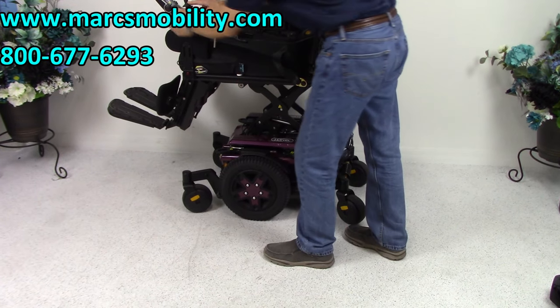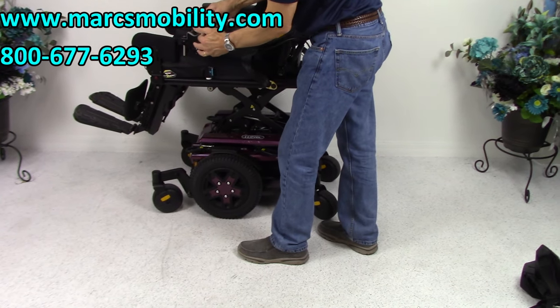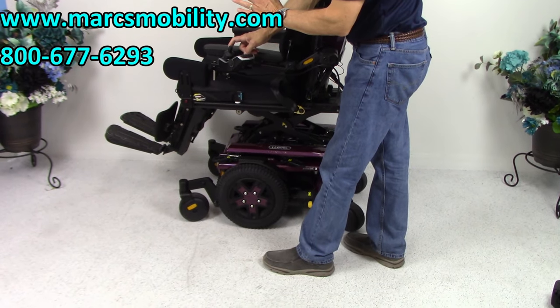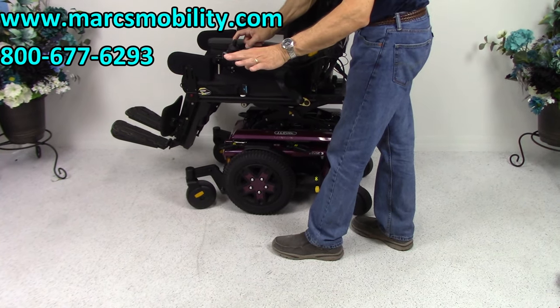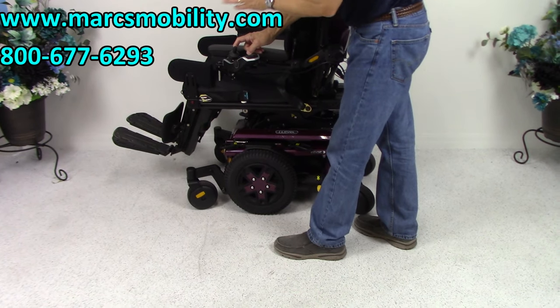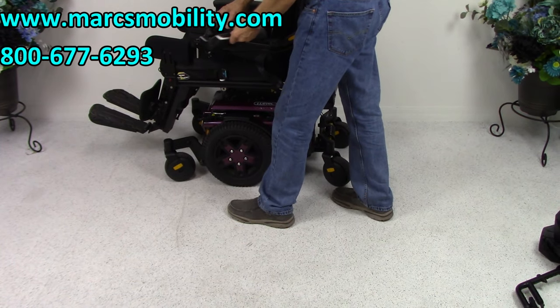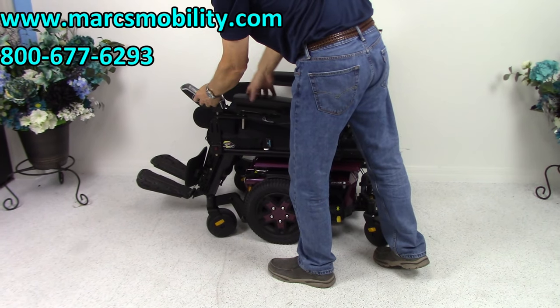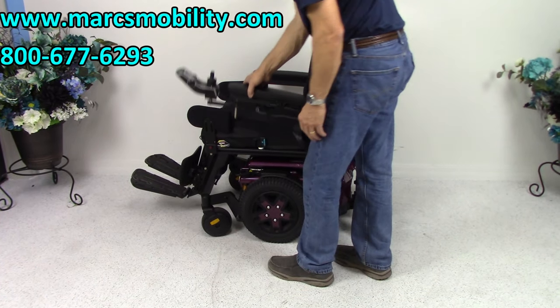Now while the seat goes down — this is called a swing-away joystick. You can swing the joystick away from the front just by doing this. Everything is currently set up on the left side, but if you're right-handed we can put everything on the right side, no problem at all.